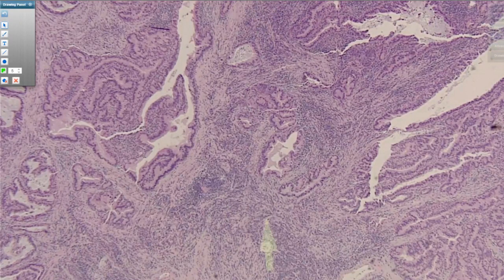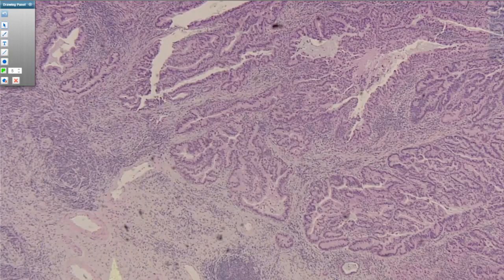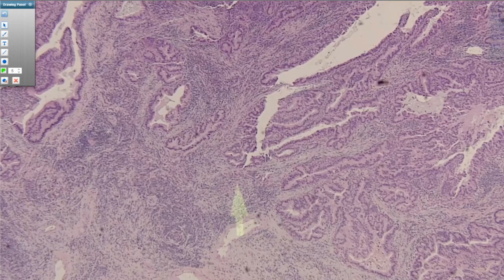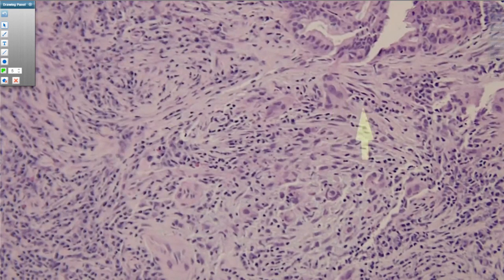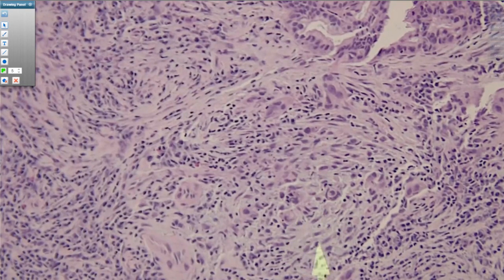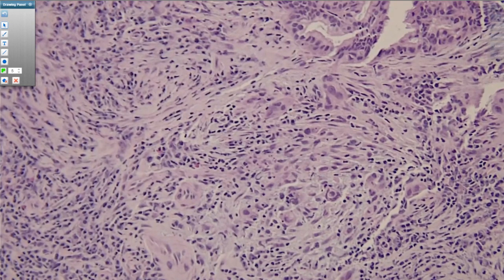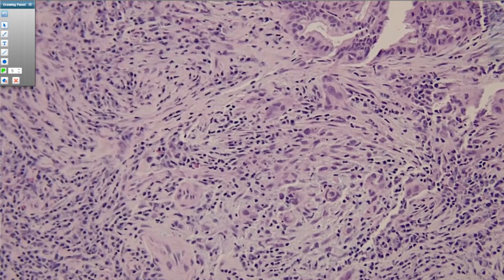You get the sense that there may be something going on, that you're getting an additional reaction to beyond just the cyst lining expanding. And then you come in here and there are these small little pink cells. At higher power, you can see we have a pretty large group of atypical cells, sometimes single cells, a little bit of mucin in them here, associated with a desmoplastic reaction in between them. And while again it's small, it's still probably 10 or 20 times more cells than in some of those suspicious areas we were looking at on that other slide.